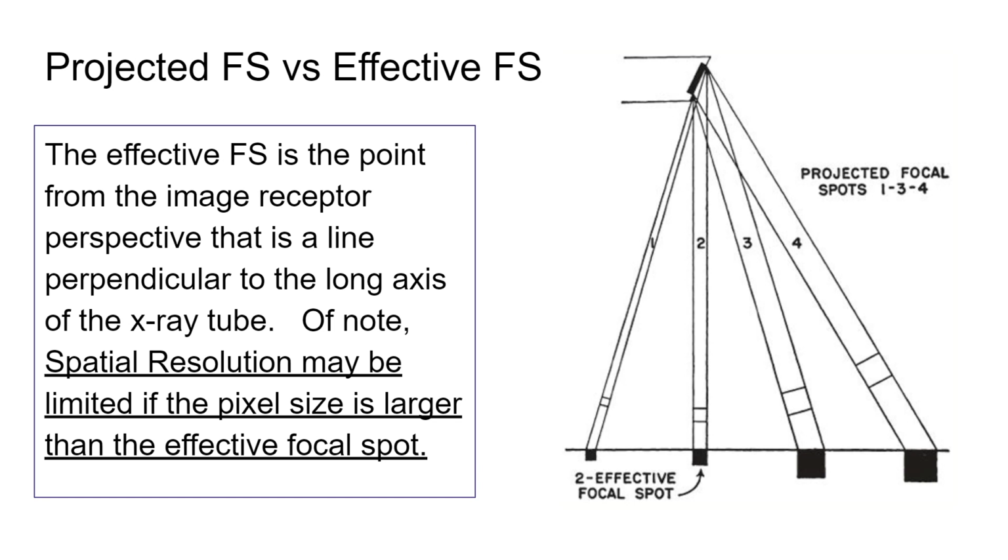So on the exams, though, unless we're specifically comparing pixels, and I talk about this particular type of limitation, it's as simple as focal spot smaller, spatial resolution higher. The only change would be if the focal spot got smaller than the actual pixel size. Then it wouldn't matter.